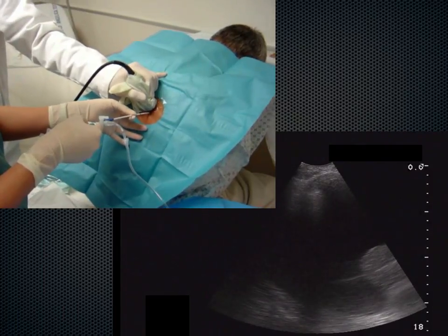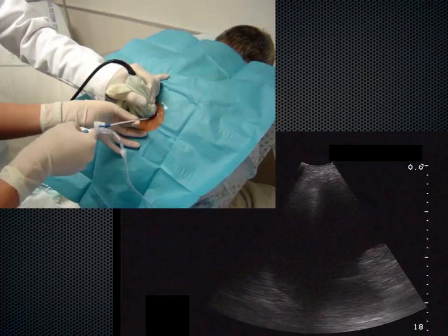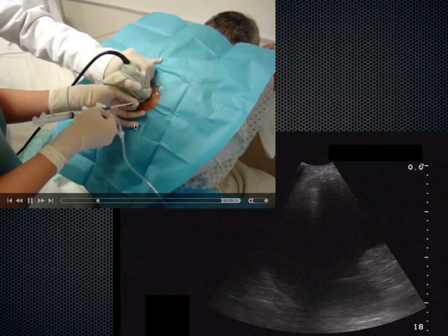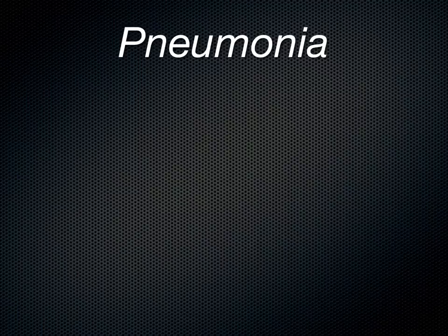Okay. See my needle. So sometimes it takes two operators depending on your kit. Just incorporate someone else in your field. This person should have a mask on. But here's an example of how you basically watch in real time what's going on.